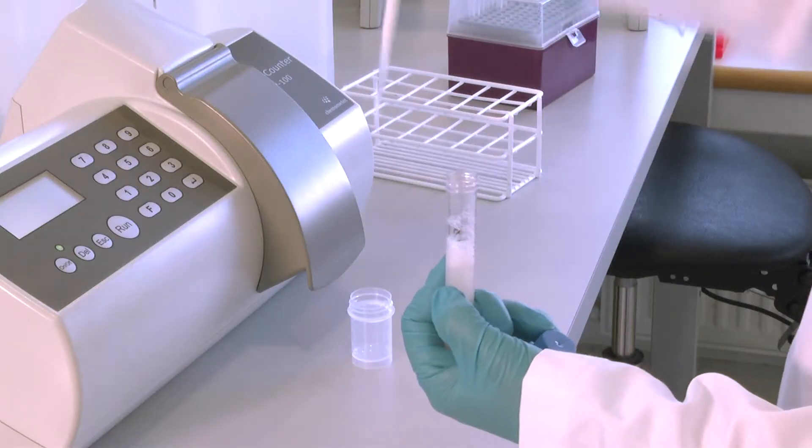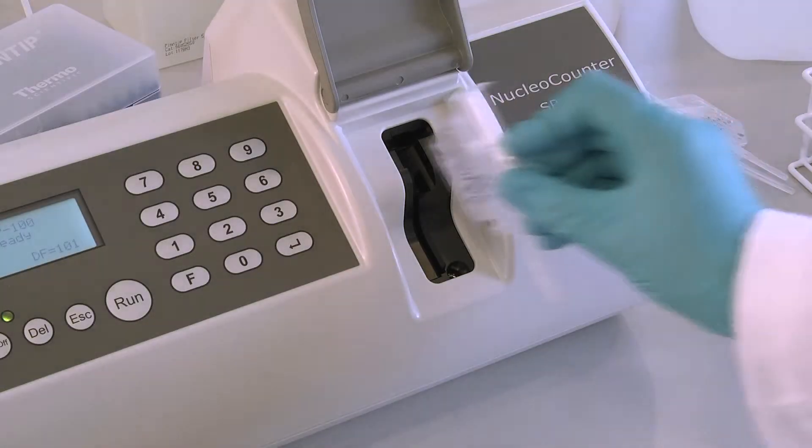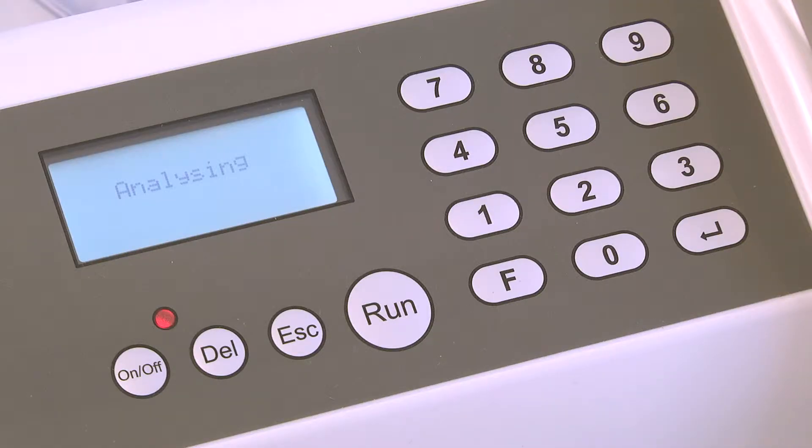Simply take a small sample of semen, dilute with the supplied reagent, load the cassette, insert and press run. In 30 seconds the instrument shows the total cell count in the display.